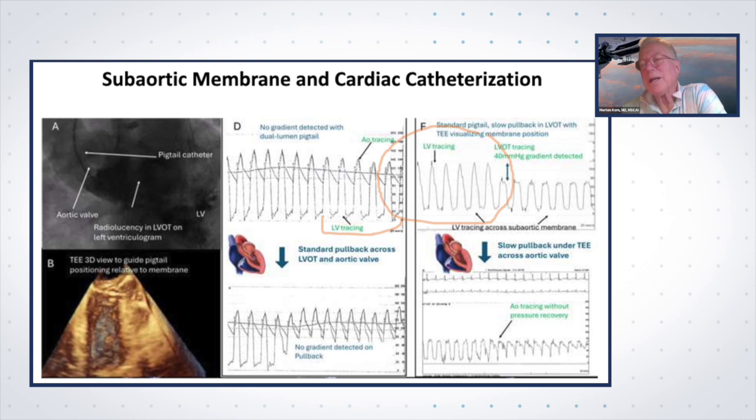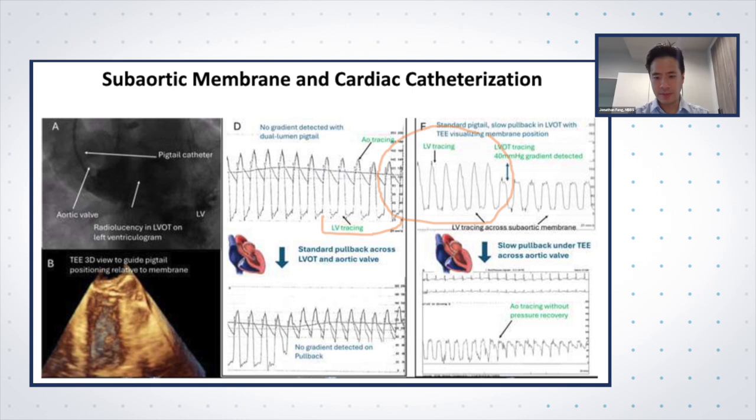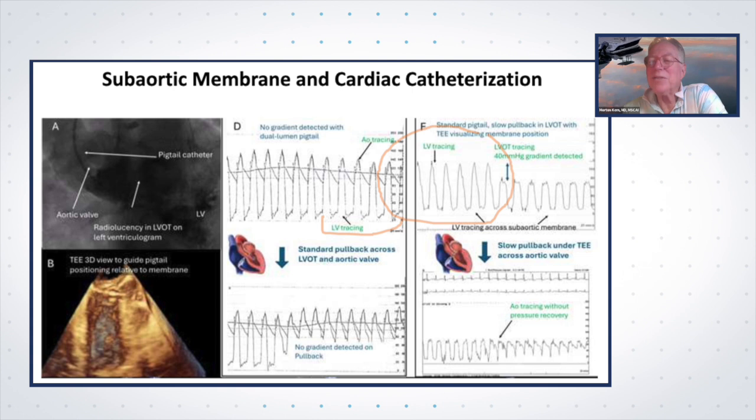Should it not? And the gradient should be across the membrane. Yeah, okay. It somehow resembles the ventricular tracing, but it's not an aortic tracing. This was the area between the aortic valve and the membrane. It sure looks like an LV tracing to me. And yes, that's why I was puzzled. I'm still puzzled. I don't know.